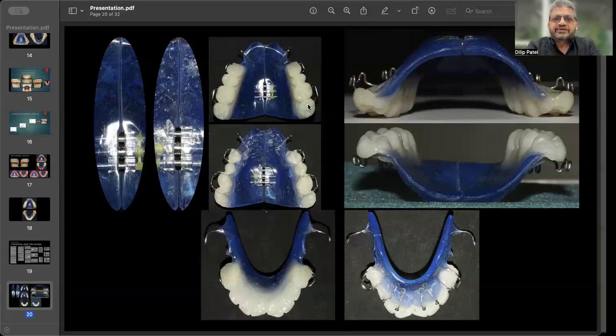In the upper appliance, you can see the occlusal trimming is given. In the anterior region it is narrow, in the posterior region it is broader, and your natural dentition is there. Interproximally, the embrasure area is also curved, so that food excursion and the efficiency of chewing can be maintained. And secondly, by maintaining the occlusal anatomy in the appliance, the proprioceptive mechanism is established immediately, and patients are very comfortable even during mastication.